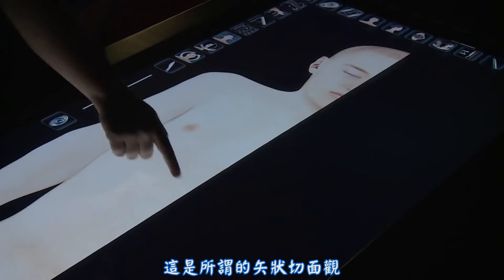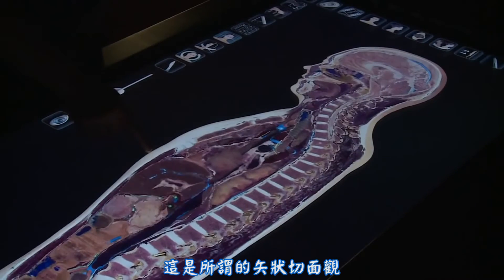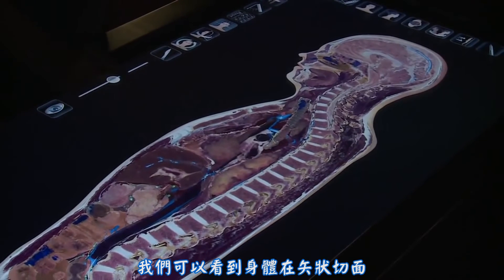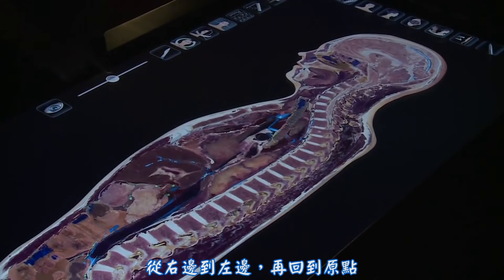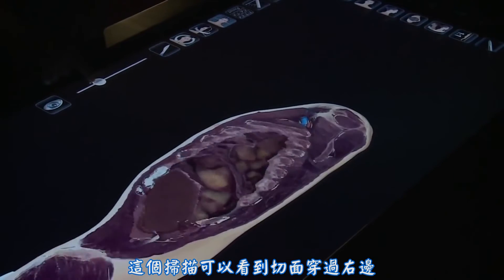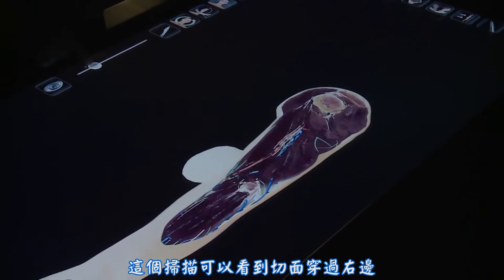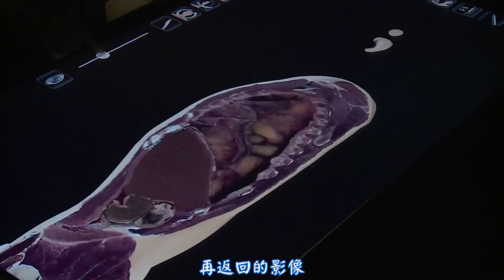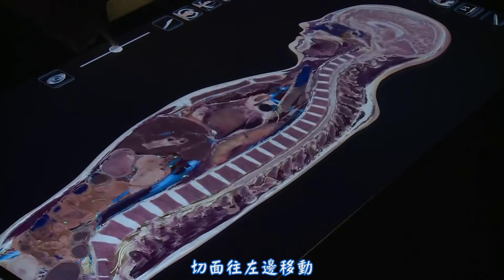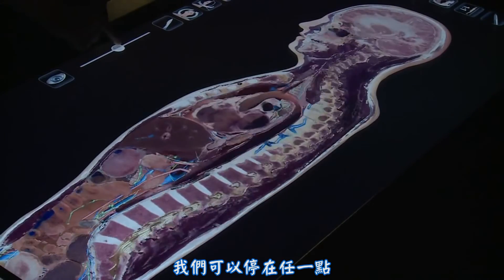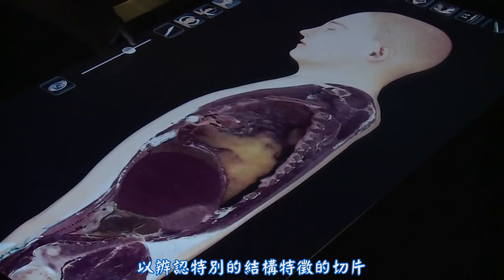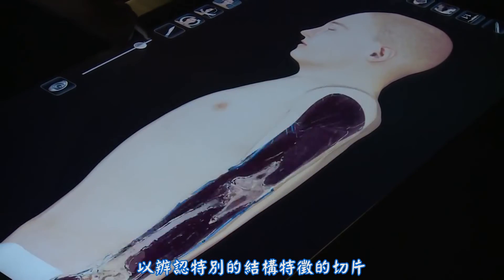And this is what we call a sagittal view. Now we can see the body in a sagittal plane going from right to left and back again. So this is scanning through towards the right hand side. Now we're coming back through the body to the left hand side. And again, we can stop at any point and identify the features that we're seeing at any one particular section.